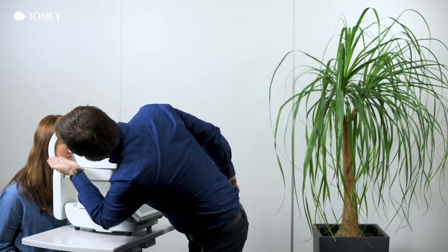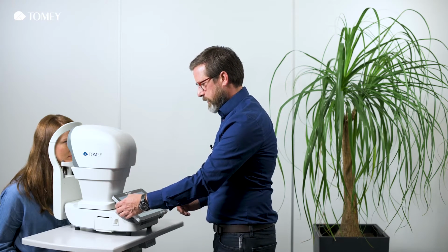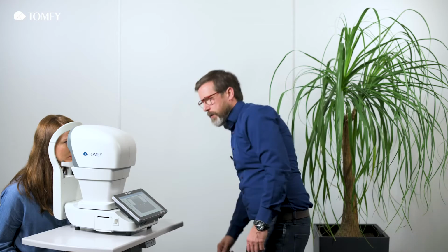So now we are working in a fully automatic way. That means the system will perform pachymetry readings and IOP readings right afterwards, and it will track from one eye to the next eye automatically. And afterwards I will show you how the measurement is proceeded with the manual mode. So now what we have to do in the beginning, of course, we have to adjust the eye level to the right place, by using the chin rest button. That looks fine.